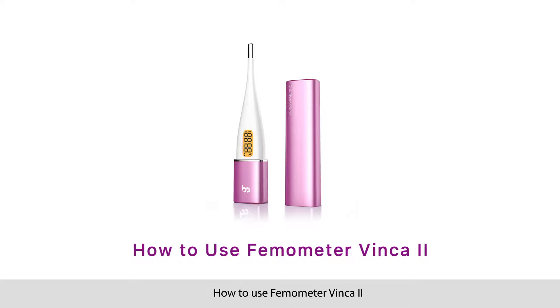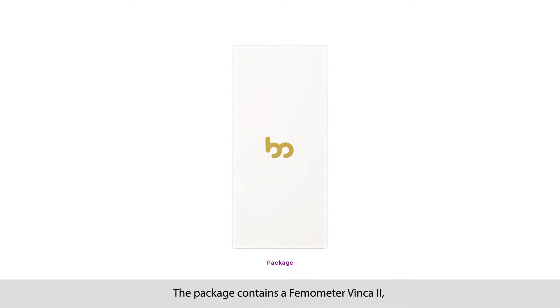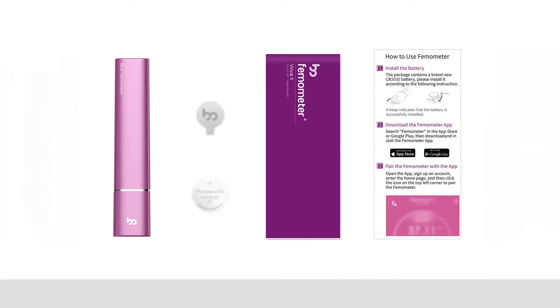How to use Femometer Vinca 2. The package contains a Femometer Vinca 2, a battery tool, a button cell, a detailed user manual, and a quick guide.